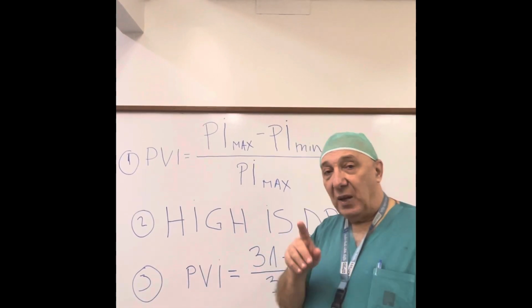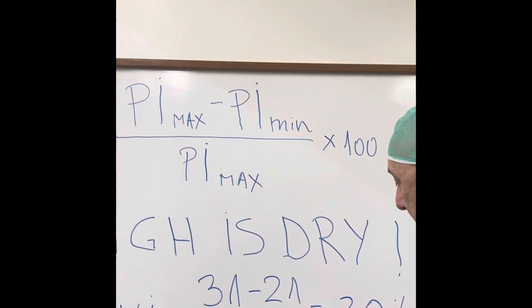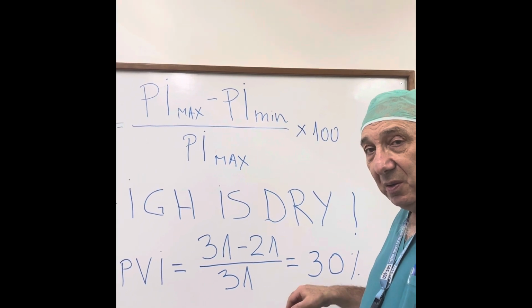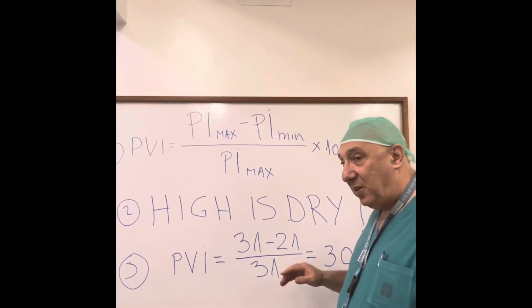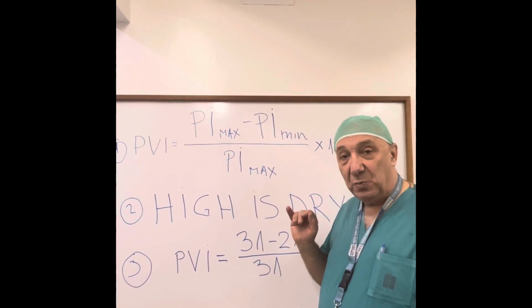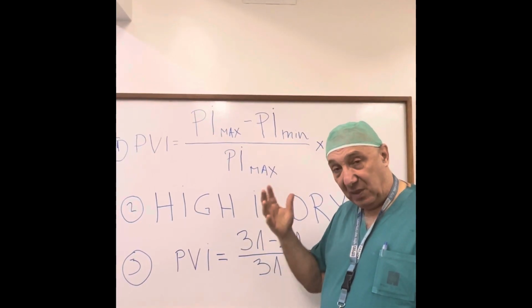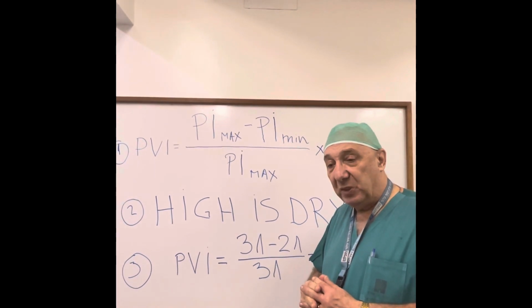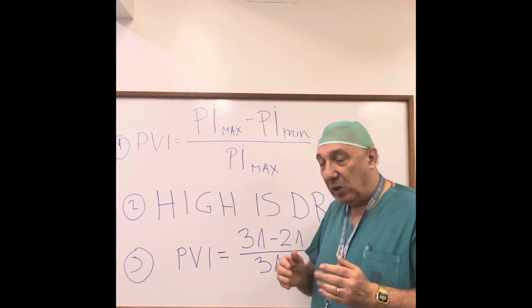Anyway, following the calculations, the measurement we have done today, her number is 30%. It's not real because there were very many perturbing factors, but as an idea, there is a theoretical cutoff point of 14%. What is more than that means the patient is fluid responsive, meaning he's dehydrated. What is less is usually fluid non-responsive. It means non-hypovolemic. It gives us an indication of what we have to do.